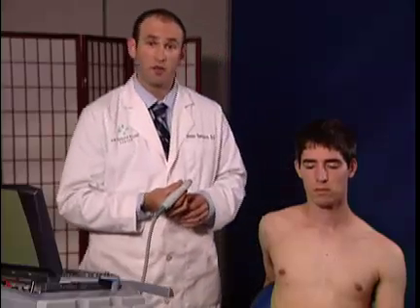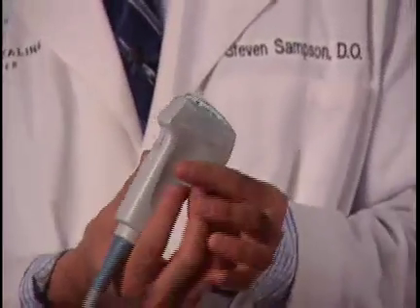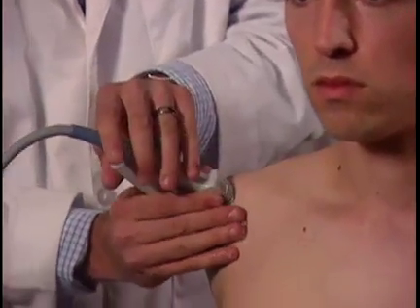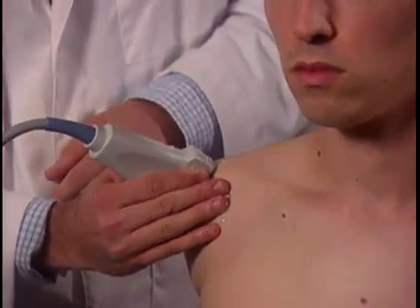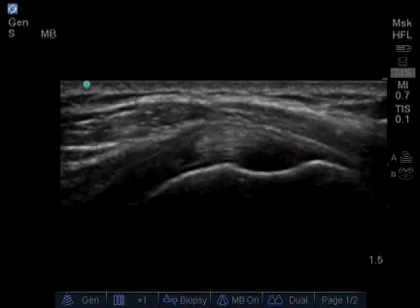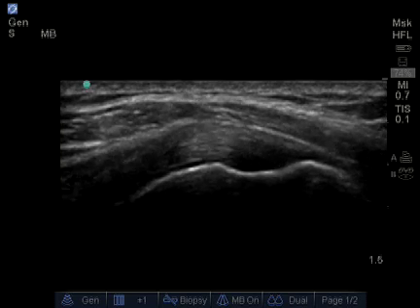Lastly, we're going to look at the supraspinatus tendon in its longitudinal view. I place the notch of the probe facing towards the patient's ear, which is an easy to remember landmark. Maintaining contact with my hand on the patient's shoulder with the probe angled up towards the patient's ear, we can see the rotator cuff in what's commonly referred to as a bird beak type image, clearly seeing the fibers of the supraspinatus tendon, which are healthy in this patient.